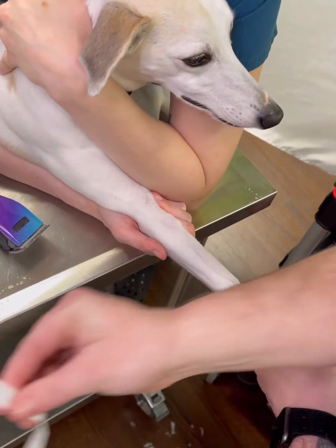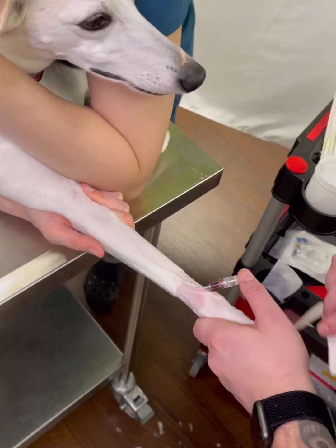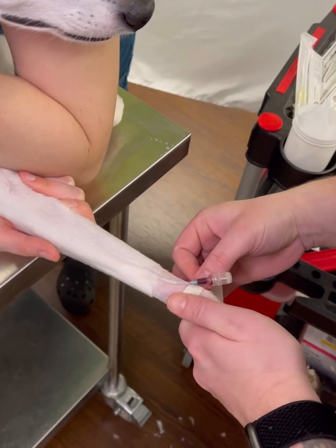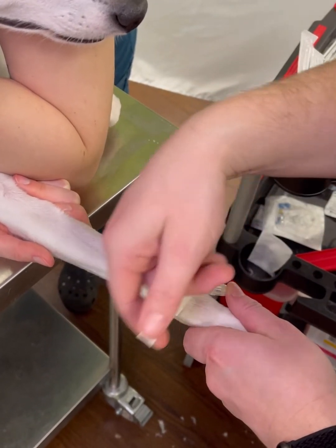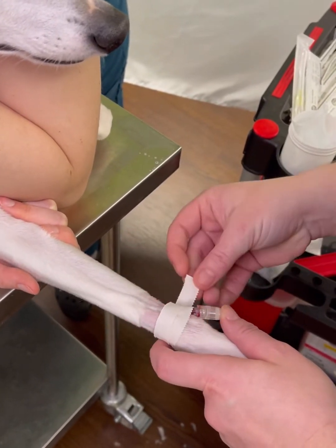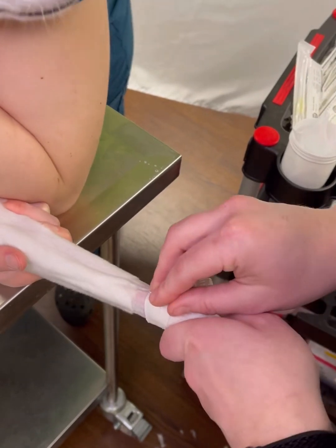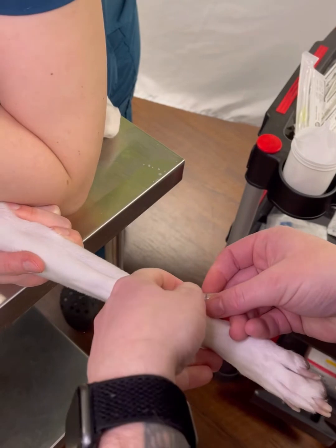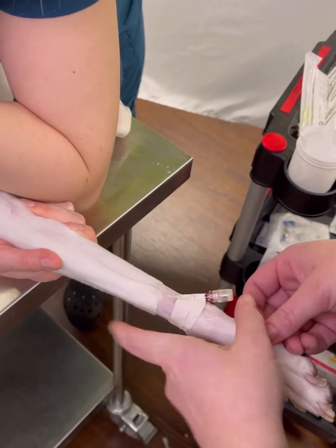You're going to grab your first piece of tape, which is going to be a skinny piece. You're going to place your tape sticky side up under the catheter, fold it to one side, stick it to itself, and then tape it around the catheter, making sure to always tab your tape on each piece. I'm going to tighten my cap after every piece of tape, just to be sure it's on.